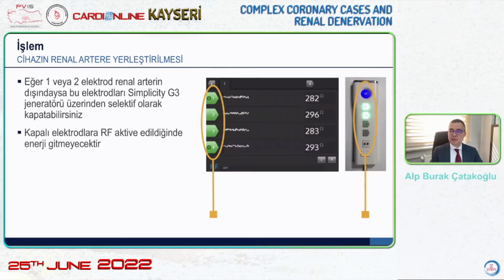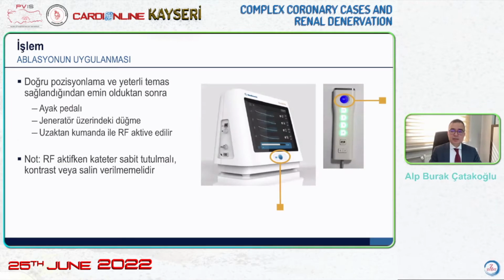If you are happy with our plans, we will decide whether we will activate all the electrodes. When we start, we want all the electrodes to be active at the ostium. When we reposition, if there are electrodes there, we can touch it and deactivate the electrode. The 4 electrodes can work together, or we can deactivate the ones that we want to deactivate.